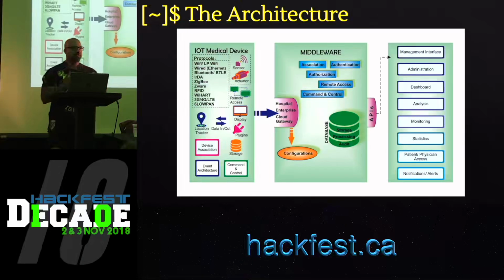Event architecture is the key module, which basically takes data and then creates an event based on that data. And for most of the connected medical devices, there will be some sort of command and control module, which would allow manufacturers to remotely maintain the device and upgrade it and so on. It could also be used by an attacker sometimes.